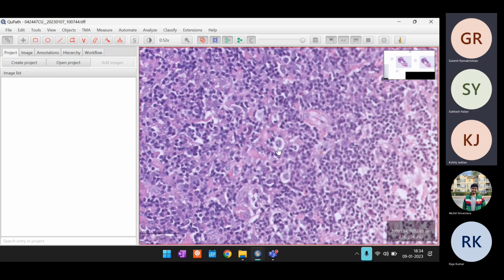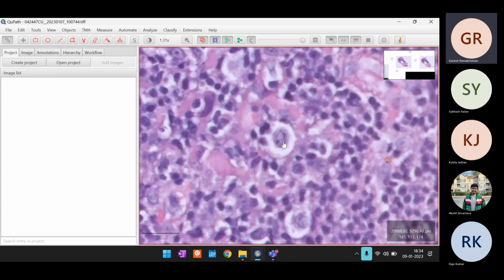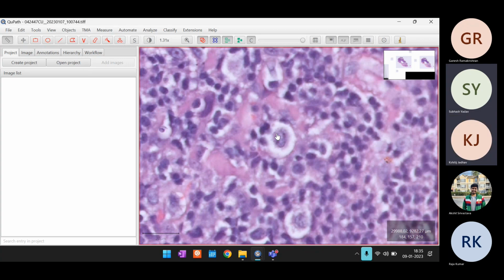Akshit, you could move there. Yes, this one. I think this by itself can also be a labeling function, right? It is, but this clearing will not always be there. That's okay.